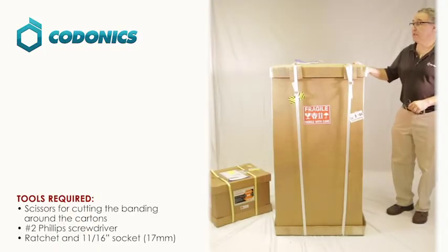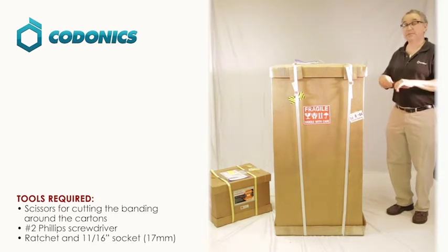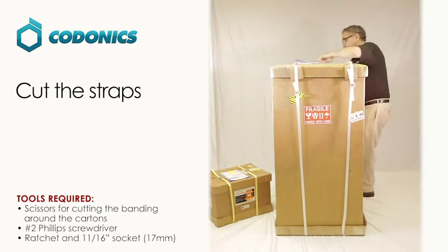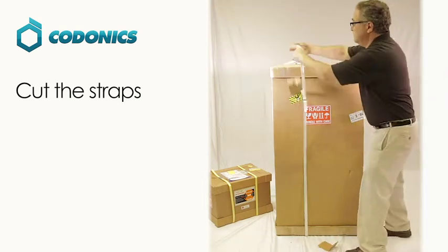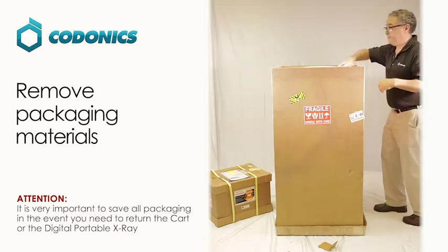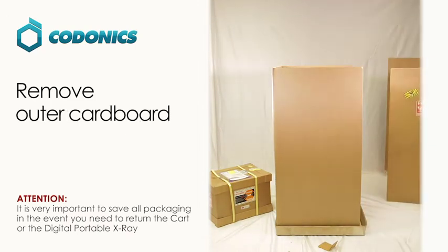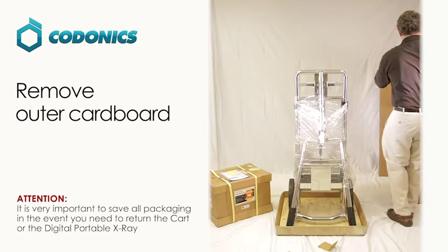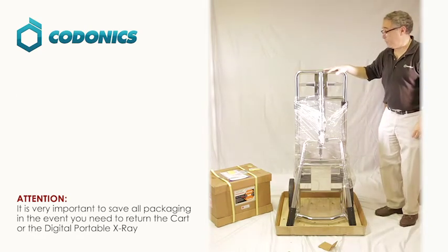First, what we have is the cart that we're going to open here. You need a pair of scissors to cut the straps. This is your cart for the digital portable x-ray.